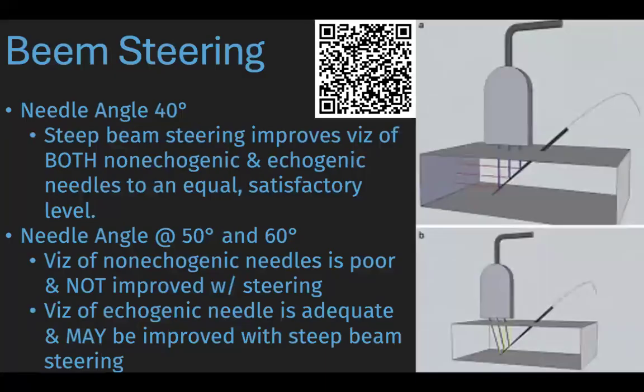And one thing I think is easy to forget is focusing on beam steering. If you can't adjust your angles with the needle angle or with the transducer, you can just adjust the actual ultrasound beam itself. This is a study that used a Pad needle with a SonoSite, and they looked at in what scenarios beam steering actually helped. You can see that at different angles, beam steering can really help with needle visualization.